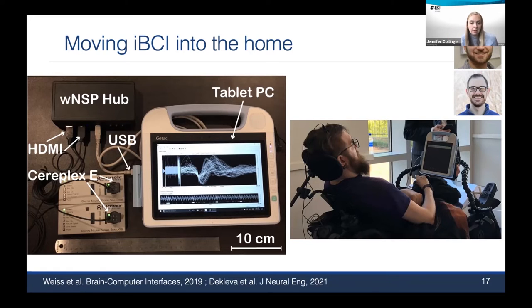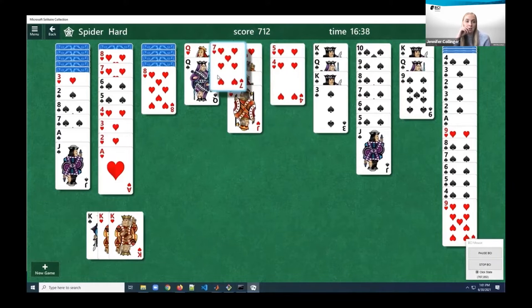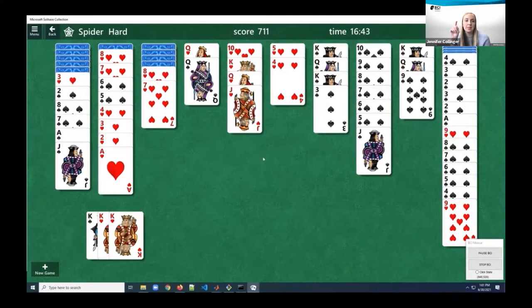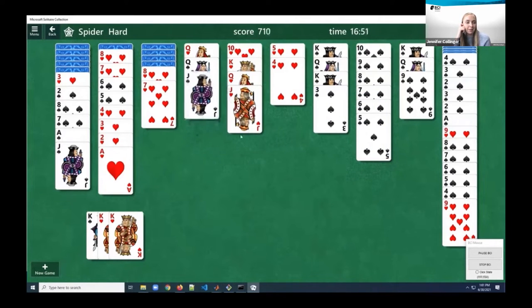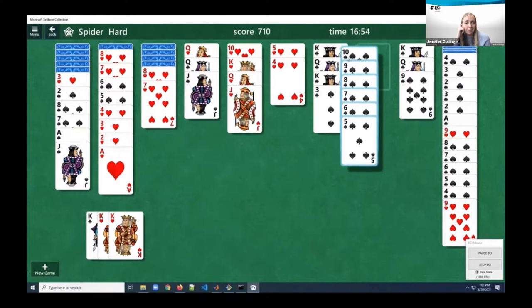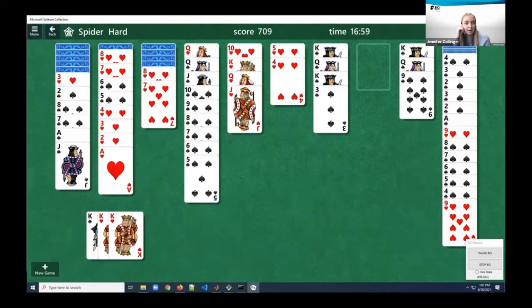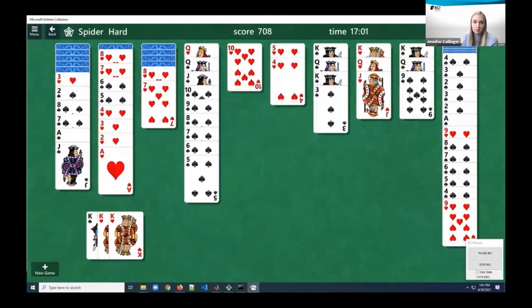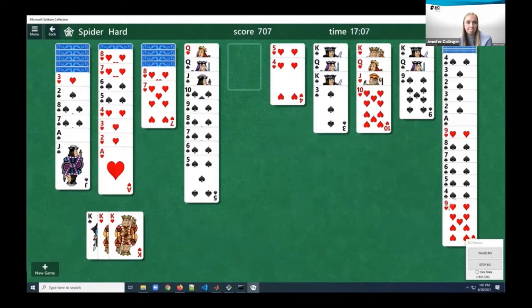To give you an idea of what this looks like, I'll show you a video of him playing solitaire using this decoder. This is completely under brain control. He's controlling the 2D movement of the cursor, as well as the click and drag feature. This is a version of solitaire I had never heard of, but apparently it's very similar, except that there's, I think, 6 decks of cards. You can see that he's able to pick up the pile of cards that he wants, drag them to the right spot pretty precisely without dropping them. So we're starting to get to the point where this is something fun and useful that they can use.